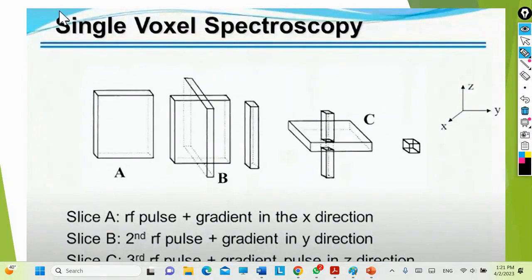So, if you add depth, like a 3D image of a city, you see it in 3 dimensions in X, Y, and Z. You see the image's length, width, and depth. When I talk about it in 2D, I see it in X and Y, but if I want to see its third dimension, I call it a voxel, right?